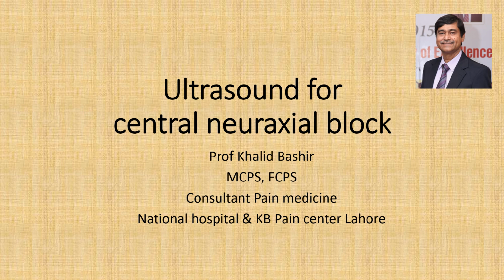Ultrasonography is being used routinely for regional blocks. Today, I will show you how to visualize the spine with ultrasound for central neuraxial block. I believe that ultrasound of the spine is more useful to learn than peripheral nerve blocks because we do spinal anesthesia more frequently than we do peripheral nerve blocks.